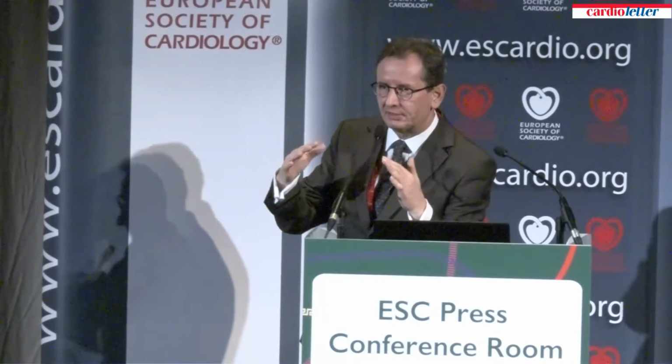You may have addressed this, but could I ask a very basic question? Could you explain the fundamental difference between these 2 types of stents, the culotte and the T-stenting? Yeah, exactly. So both techniques are according to the provisional T-stenting approach. So our philosophy is to try to treat patients with one stent. Usually if you use tap stenting or T-stenting, you place the first stent in the main branch, then you open the struts to the side branch and implant a second stent in the side branch and do final kissing balloon dilatation. In the culotte stenting group, you have 2 options.